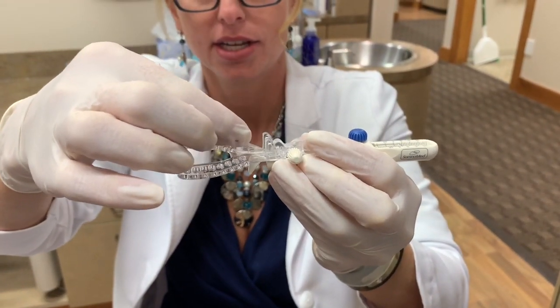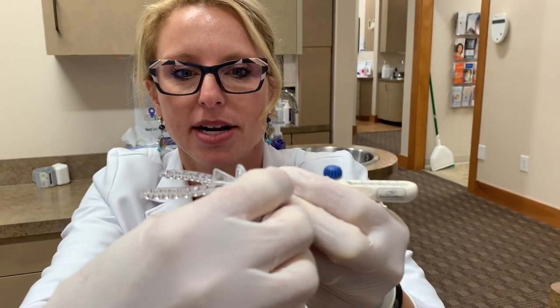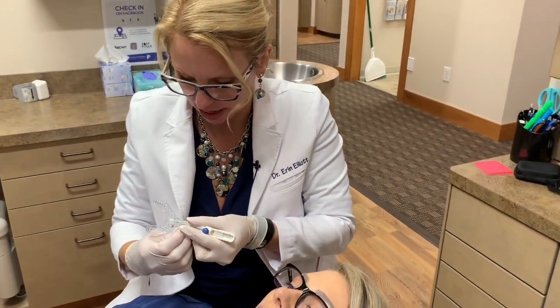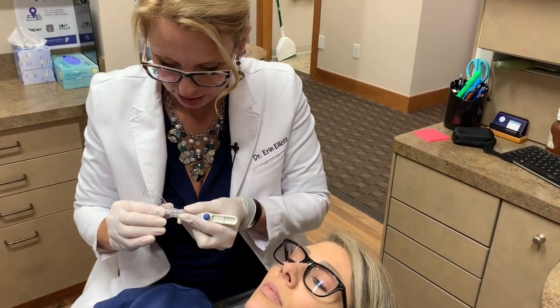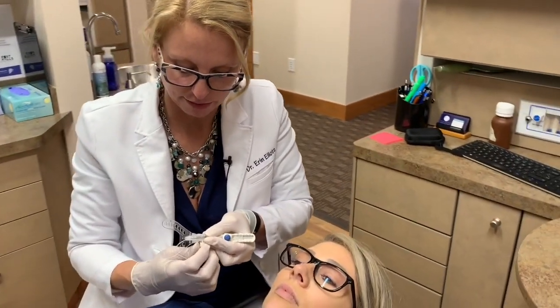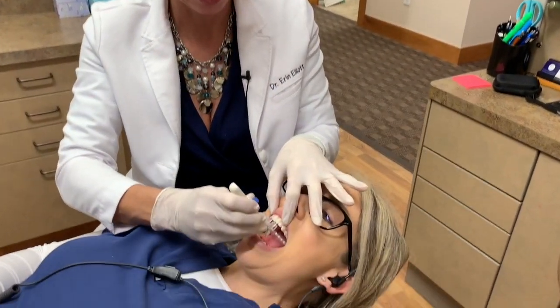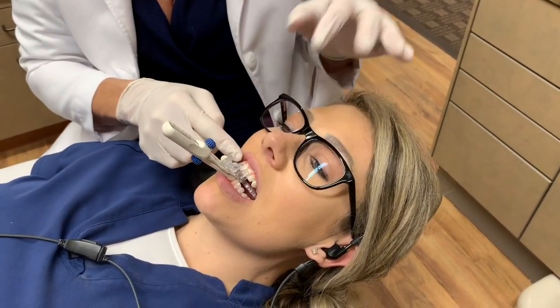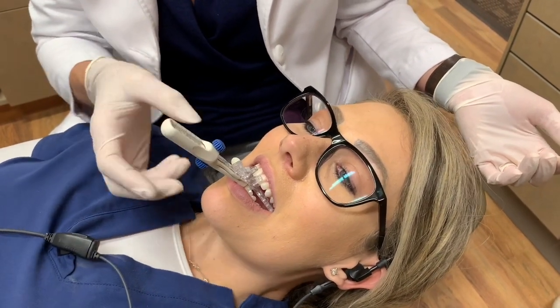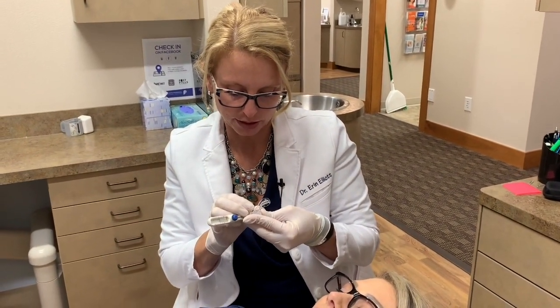The way you adjust the vertical is with this screw right here. I loosen that, and on this ramp there are numbers. You can adjust this vertical part right here — see how this slides? We put the line to where it's even with the vertical part. This would be a vertical of 6. I'm going to adjust that. So we're going to do a vertical of 6 — go ahead and put that in and bite down. You'll see you can't bite down as far. Notice a difference? Go ahead and give us a snore. Then I'm going to go to a vertical of 8, just to see.